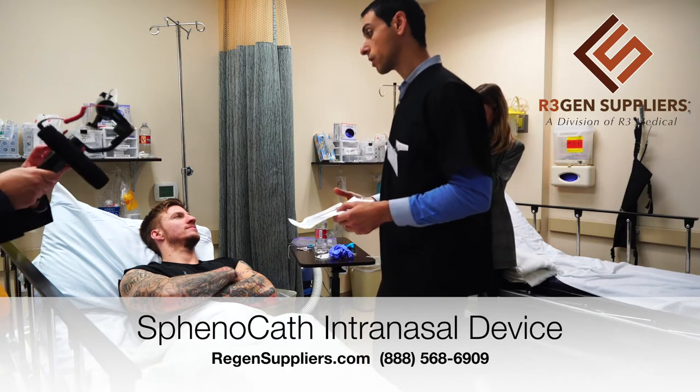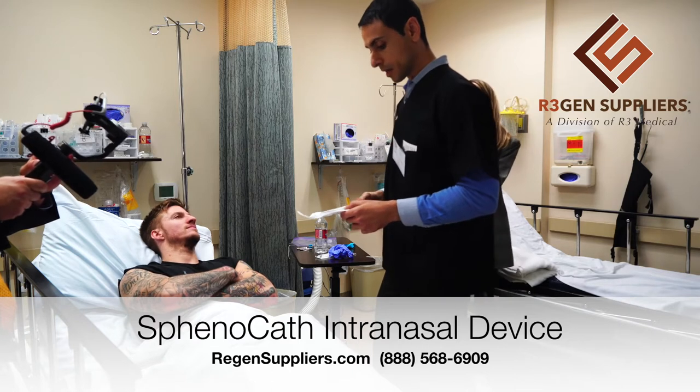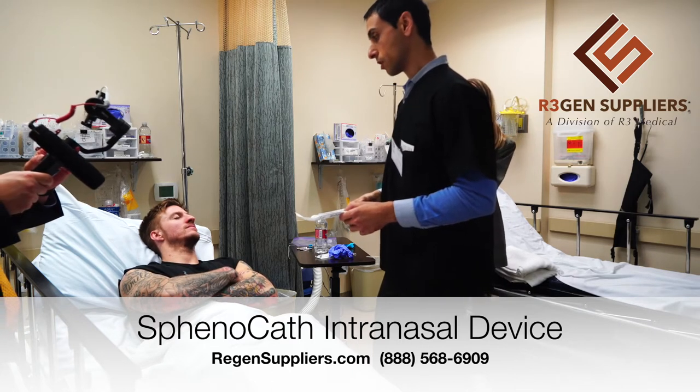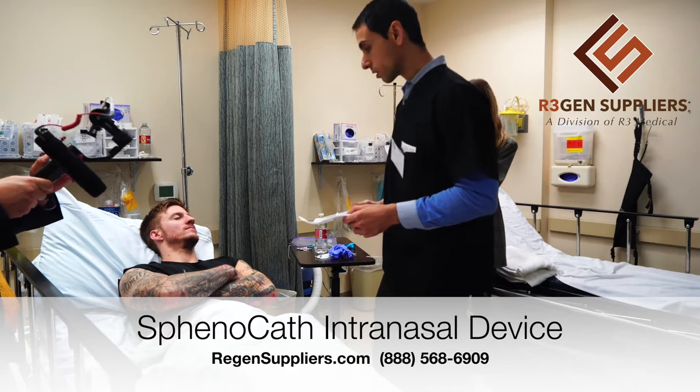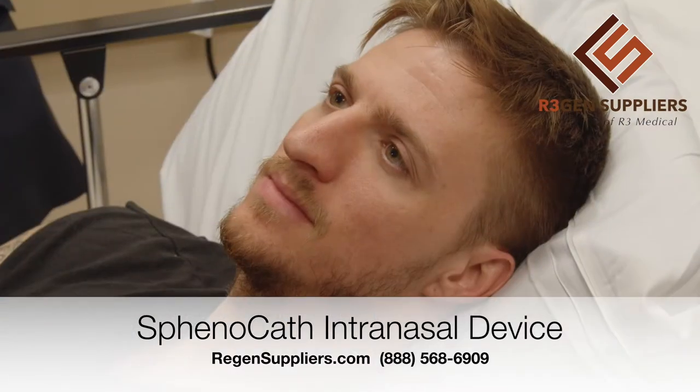We're not going to mix it with lidocaine, so you won't have that immediate effect of the nerve block. But since we're going to do it with stem cells, it should have a longer term effect, so hopefully that will reduce your headaches as well.